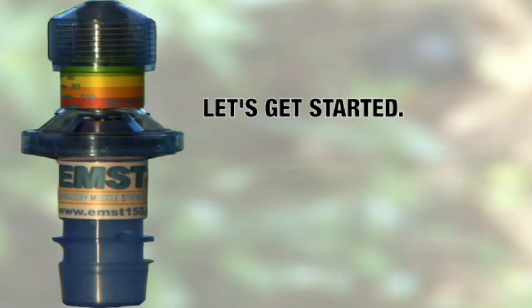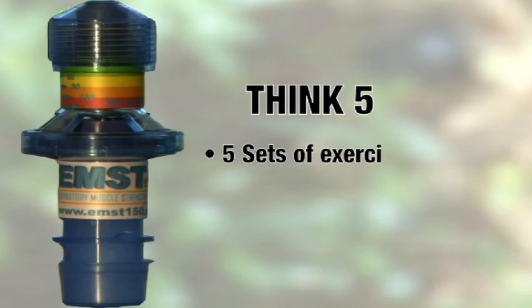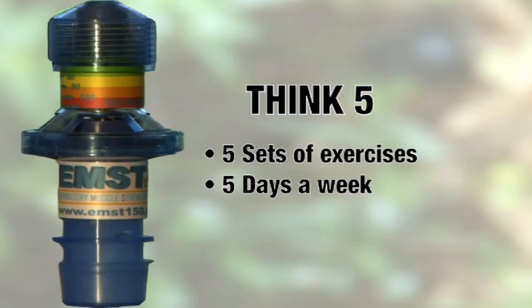The key to successful training is to think five. You will do your training by completing five sets of exercises five days a week for five weeks.